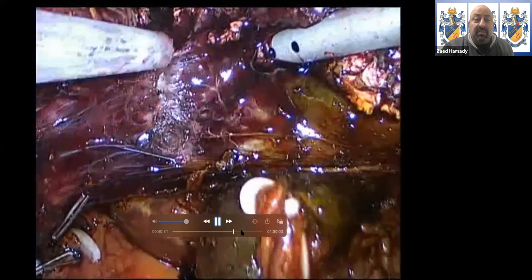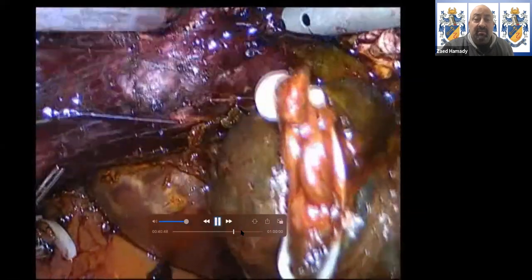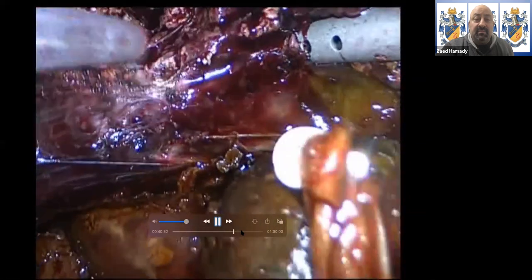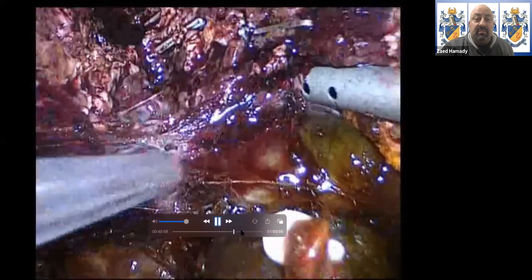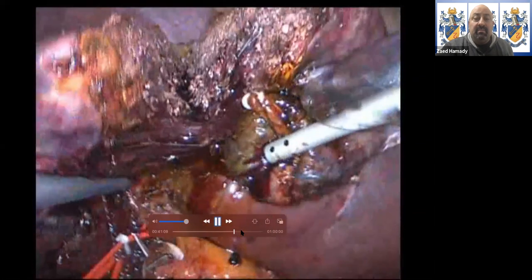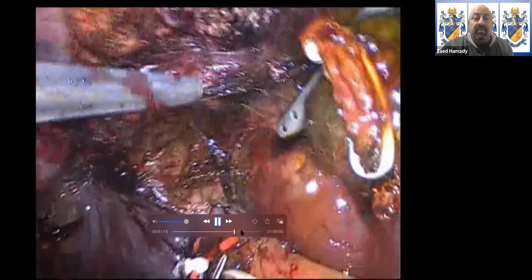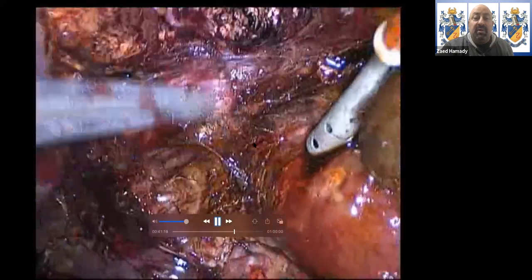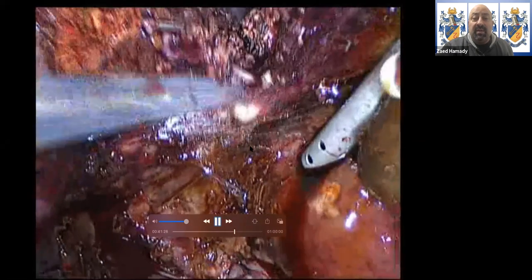Now this has started to be just above the hilum, so that's why it's a little bit more red color. And you can see the direction is I want to direct myself towards the right side of the vena cava. And gradually I go through what, if you want to call this segment 9, we usually call segment 9, just for ease of identification.